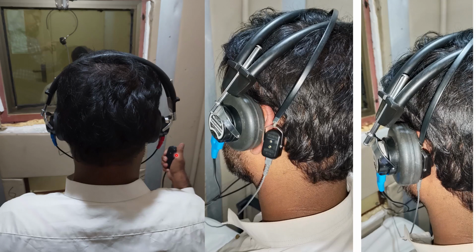As already mentioned in the previous slide, if the patient presses the button 50% of the time at a specific frequency, like for example at 500 hertz, if the patient presses this button at 30 decibel 50% of the time, then that 30 decibel is the hearing threshold at that particular frequency, which is 500 hertz. In this way, all the frequencies already mentioned will be tested.